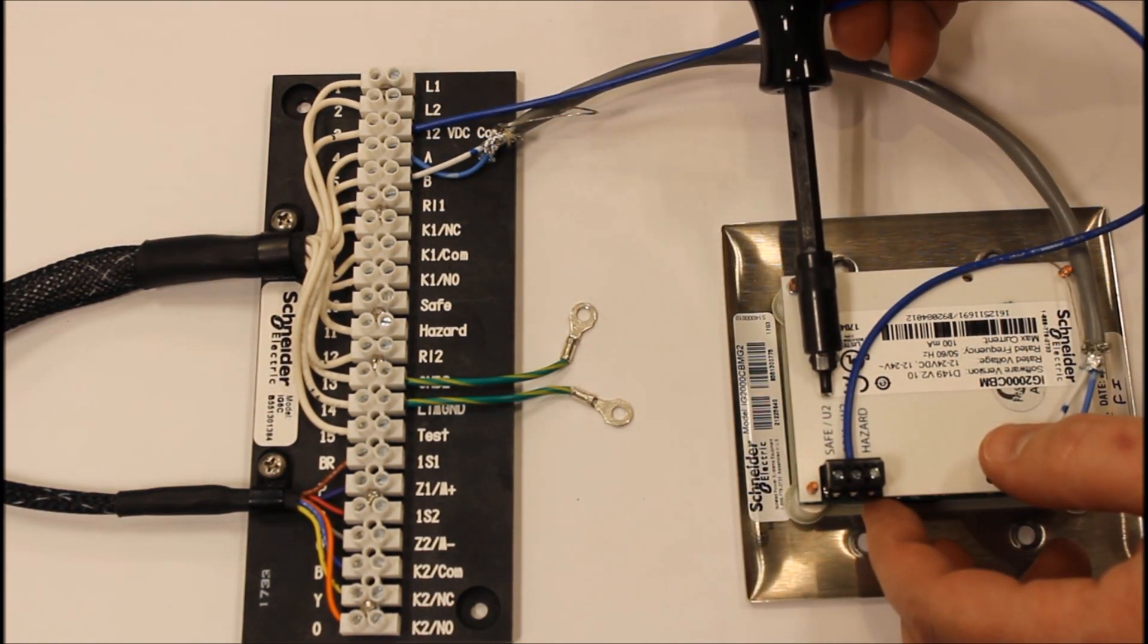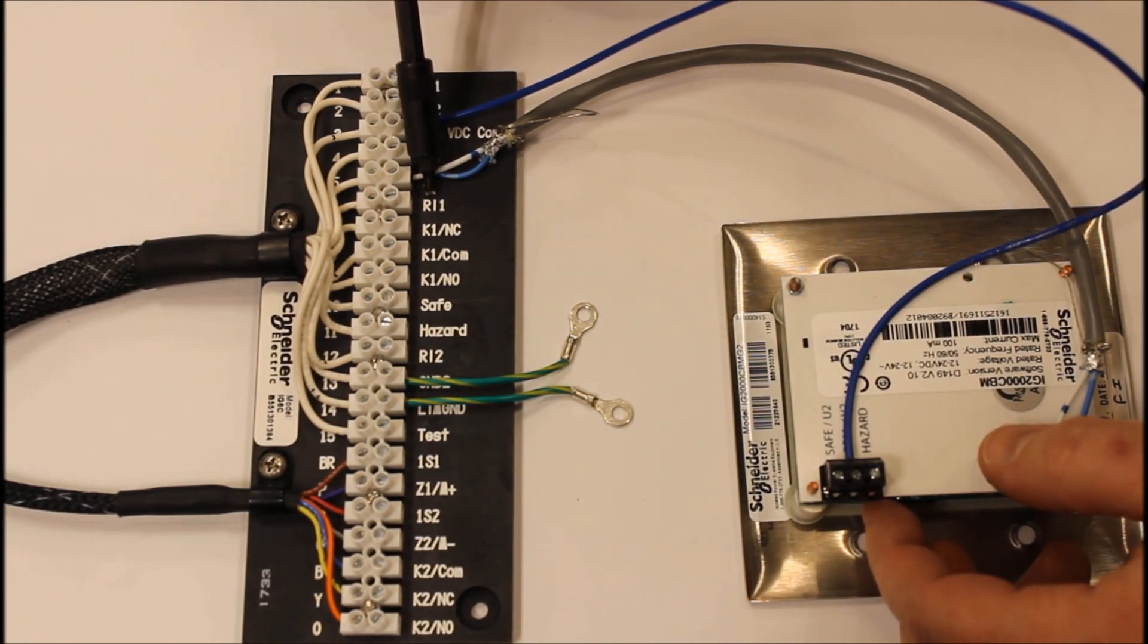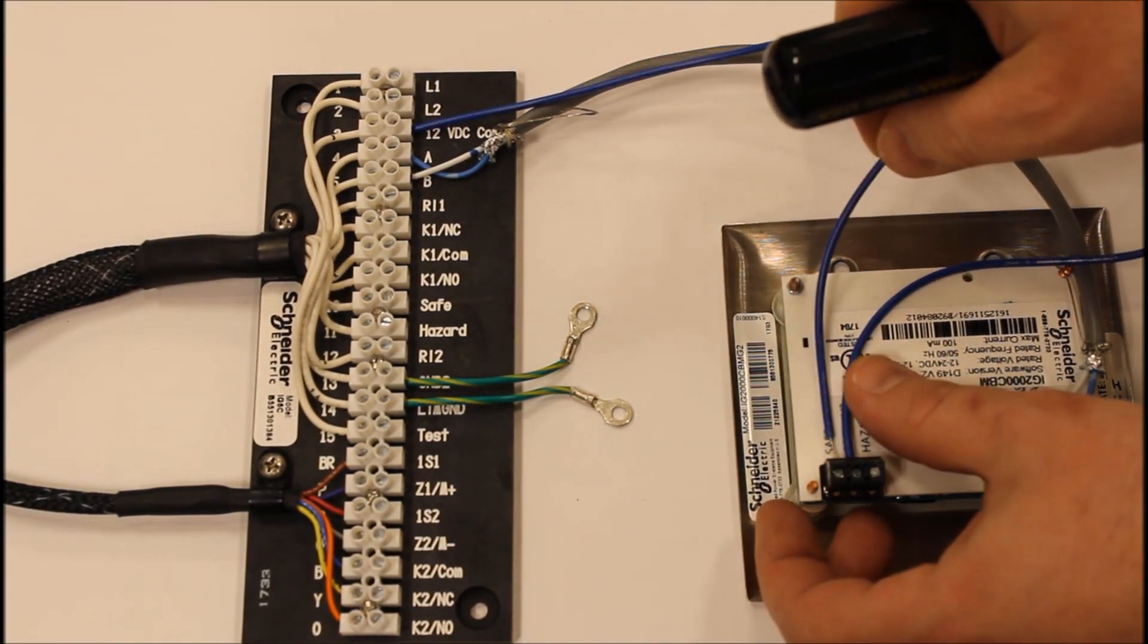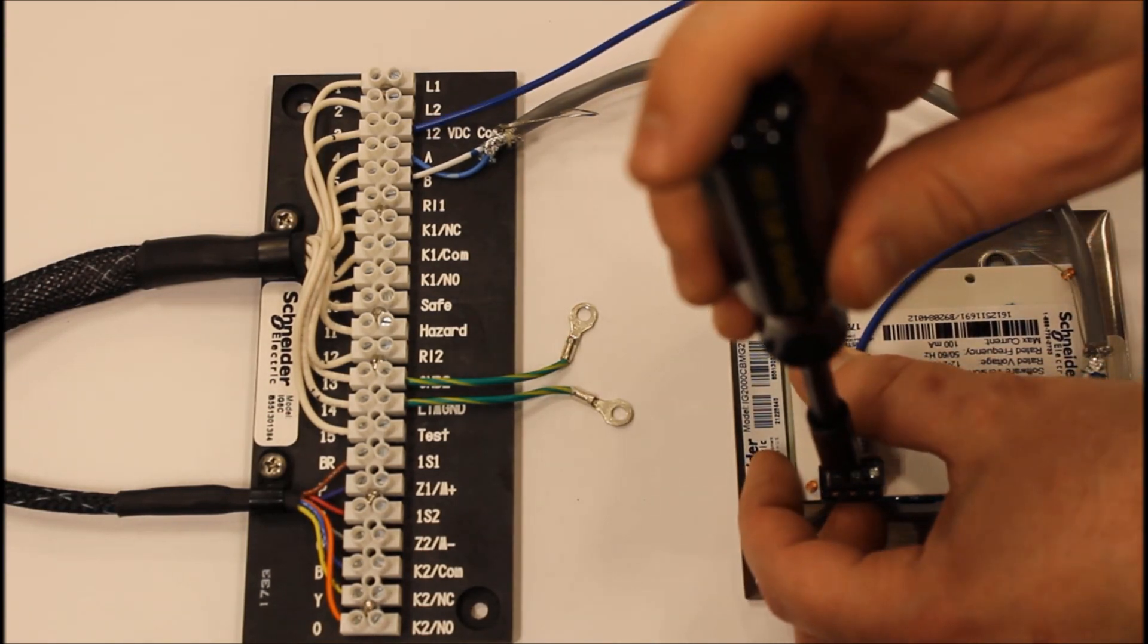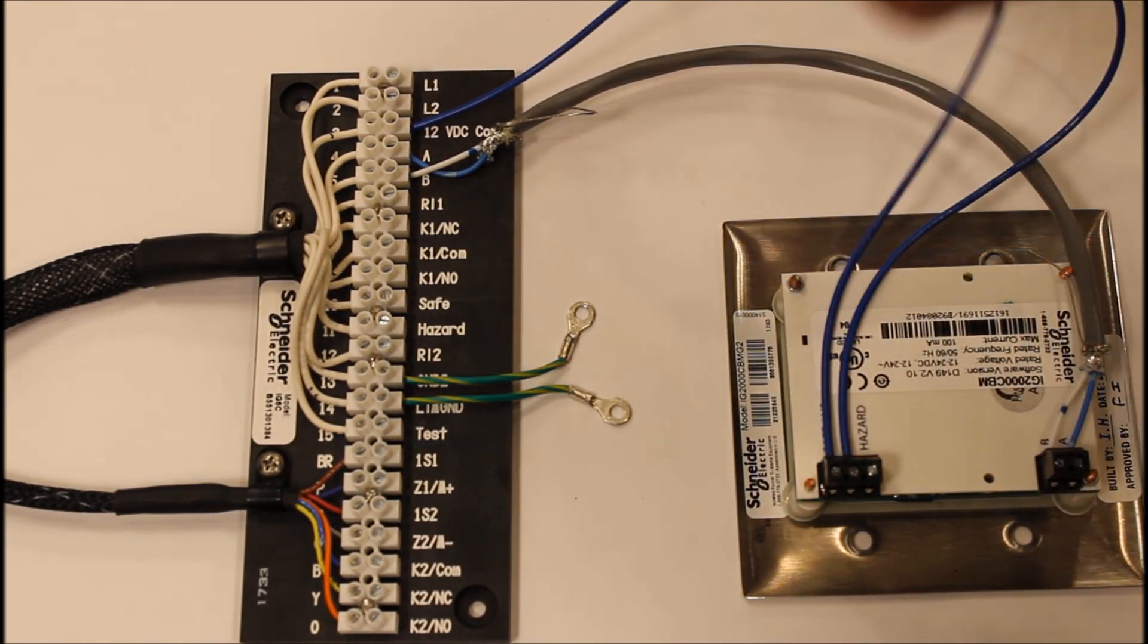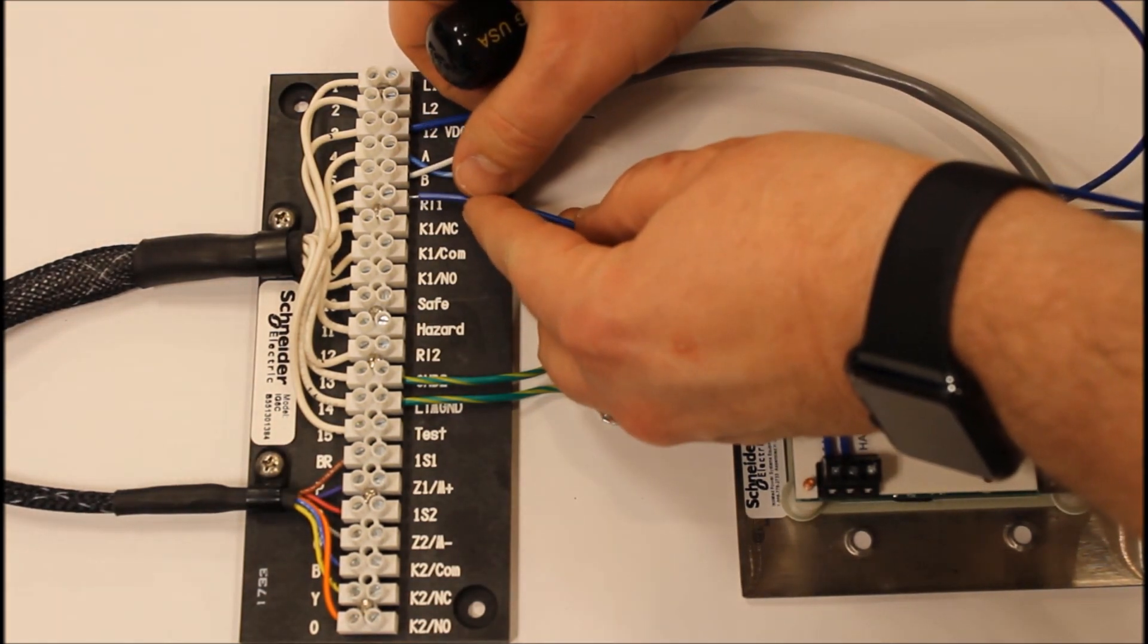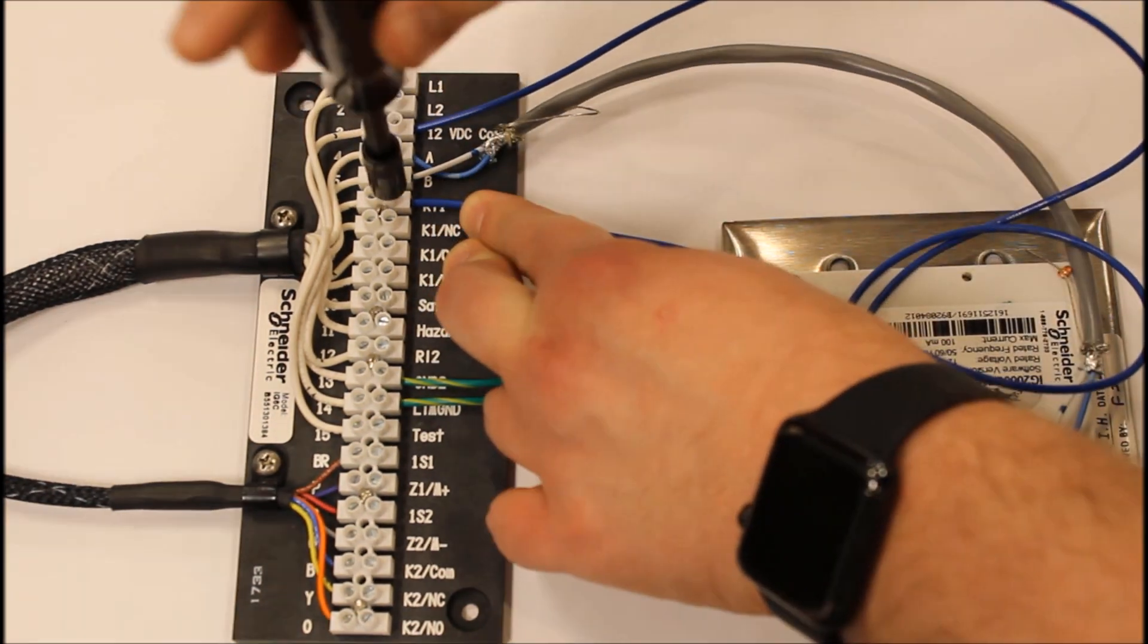The next thing we have is our safe button. We're going to connect that safe button to the RI-1. This is the only connection that will need to be made because the safe and hazard button works together harmoniously within the IG-2000 CBM.